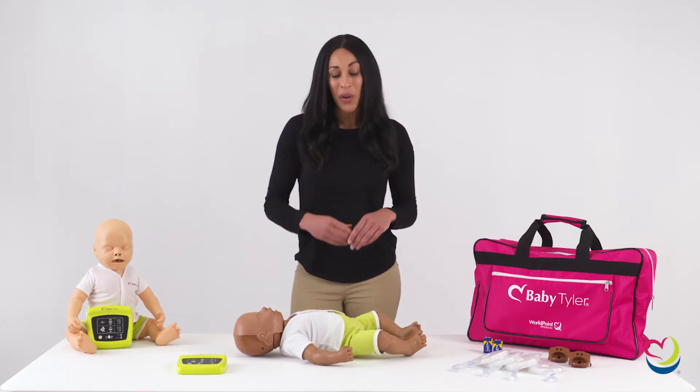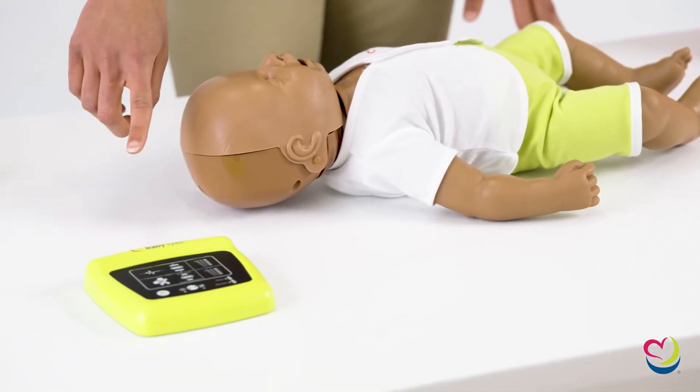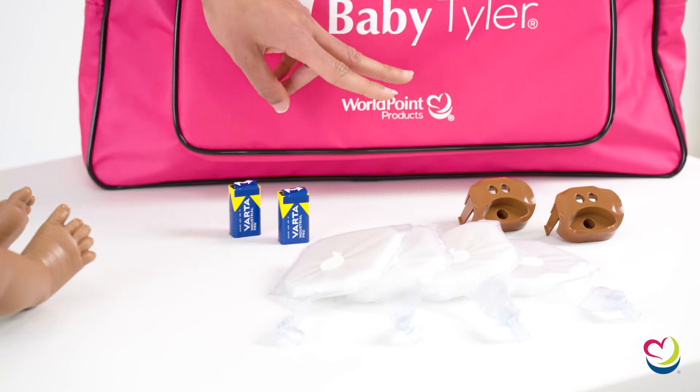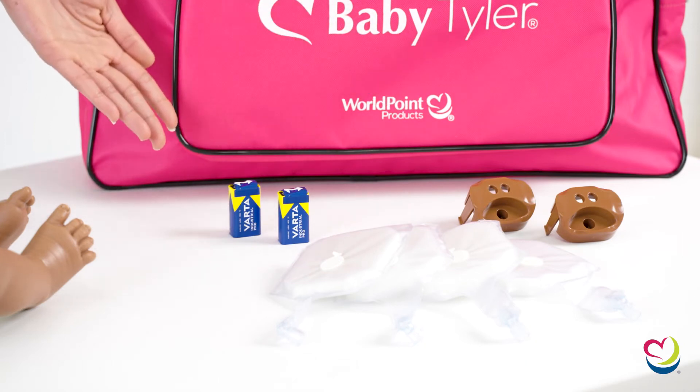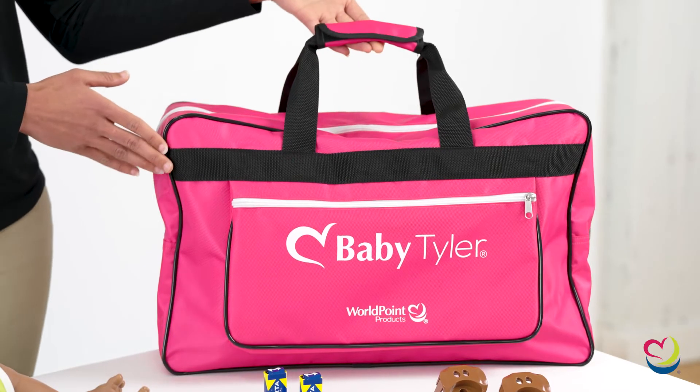With Baby Tyler, you get one Baby Tyler infant mannequin, one wireless CPR monitor, four lungs, two mouthpieces, two 9-volt batteries, one user manual, and a transport bag.